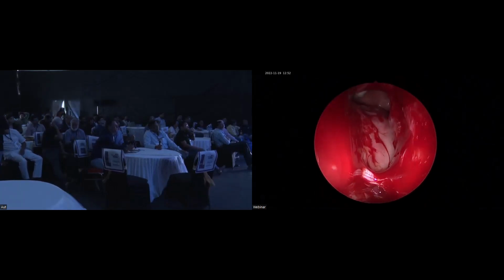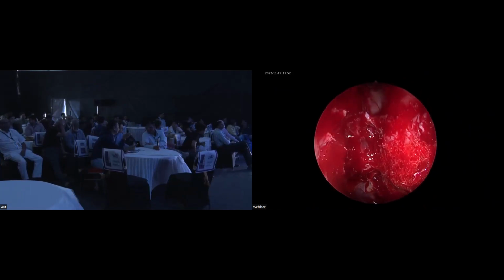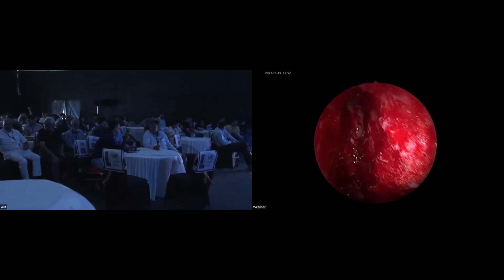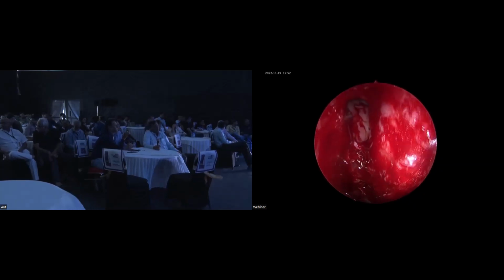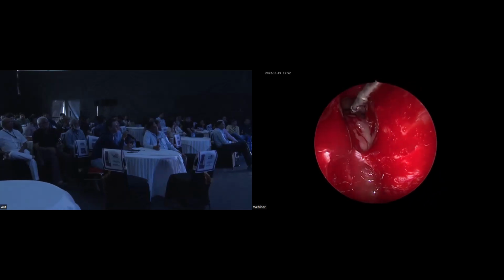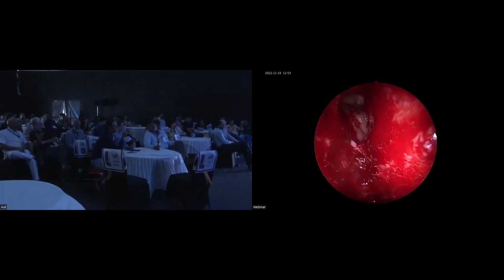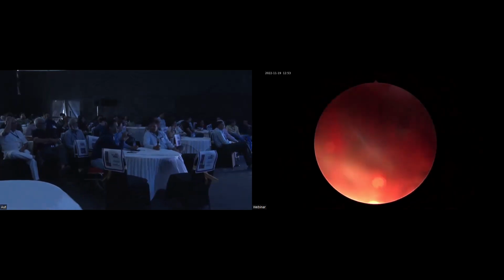Giraffe forcep दे दो. Let me see if I can. This will not reach, beta. Giraffe, frontal. I will try if giraffe reaches to remove that secretion. It is upward and it's in one of the crevices. Anyway, हाँ वॉश दिया मैंने उधर नहीं पहुंच रहा है. Very strong. 4-5 times I give.